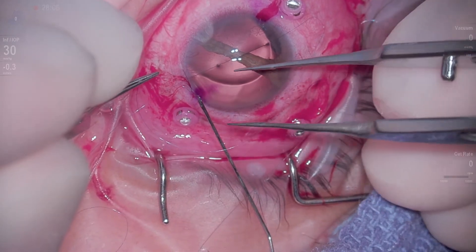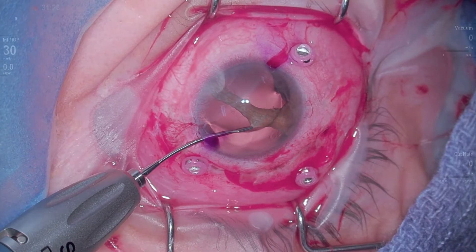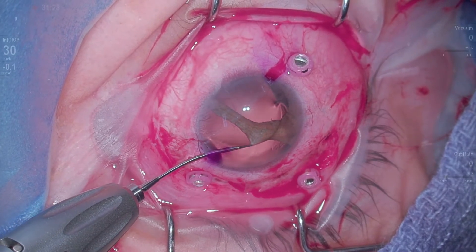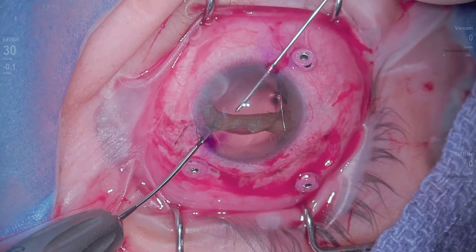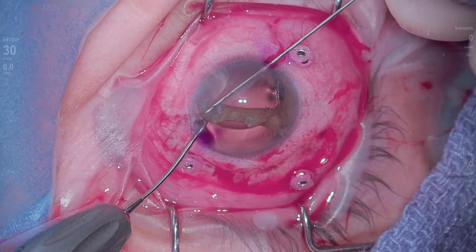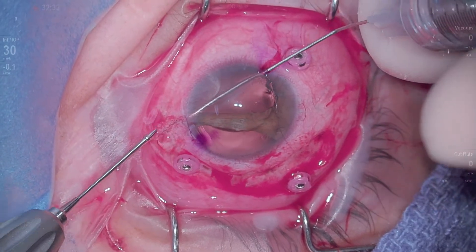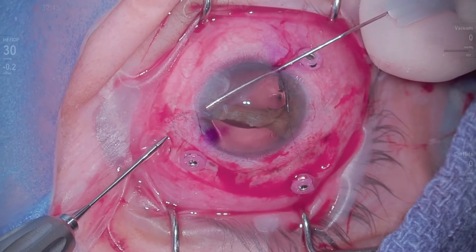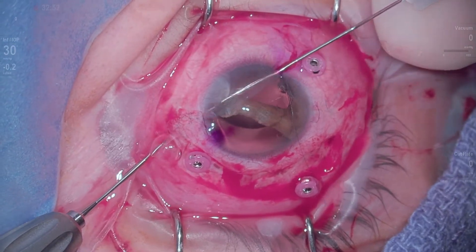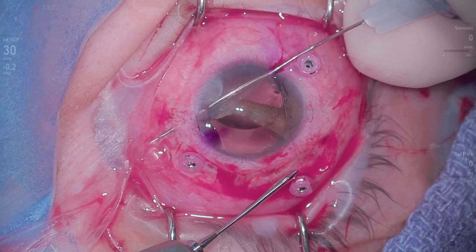I'm retro-loading a needle here with a 9-0 proline, and that is probably one of the most difficult parts of this entire case. We've made a paracentesis and we're using these really nice MST forceps to help grasp the iris and get it in position. We then basically penetrate the iris with our needle that's got the suture loaded, and we're going to come out in an appropriate position through the sclera.